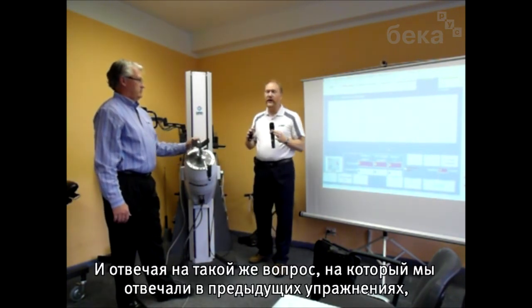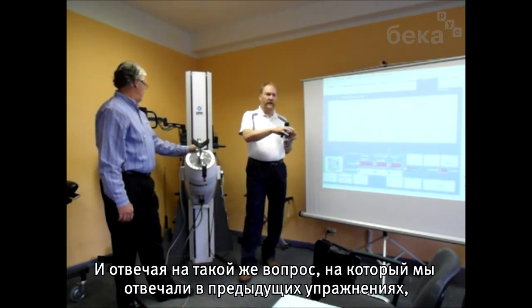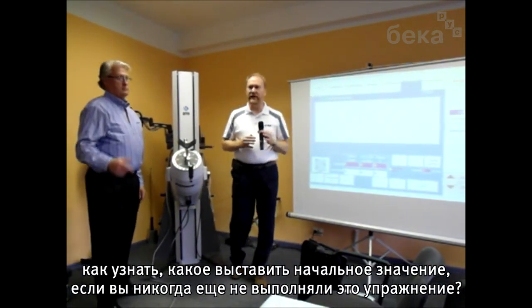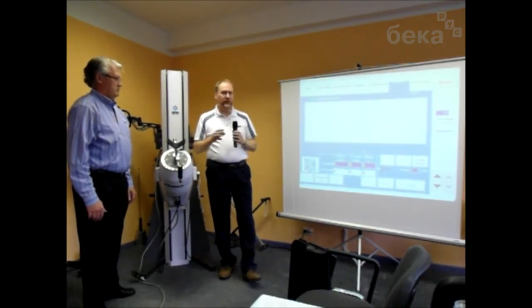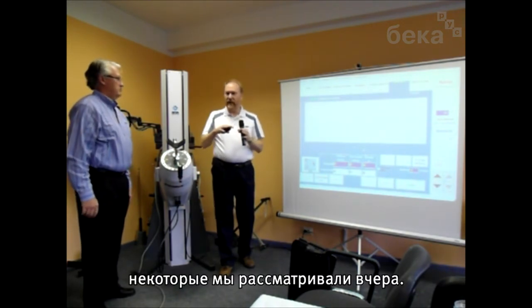And the same question now comes up that we just answered earlier regarding the target forces for isometric and CPM. How do you know what resistance to set for this person the first time they do the exercise if they've never done that exercise before? How do you know what an appropriate level is? Well, there's a couple ways you can approach that. I mentioned them in the PowerPoint yesterday.